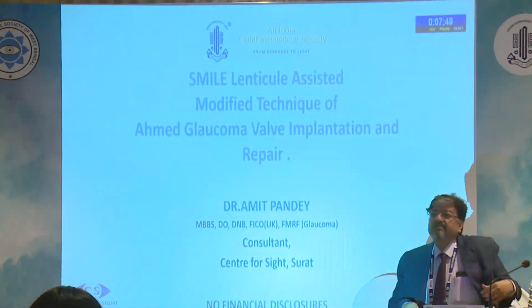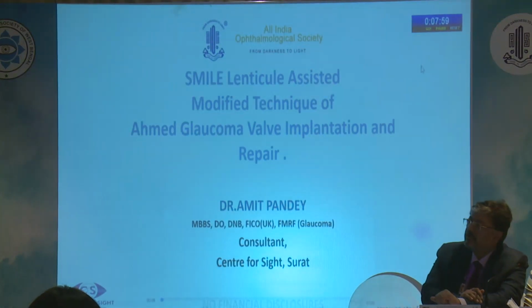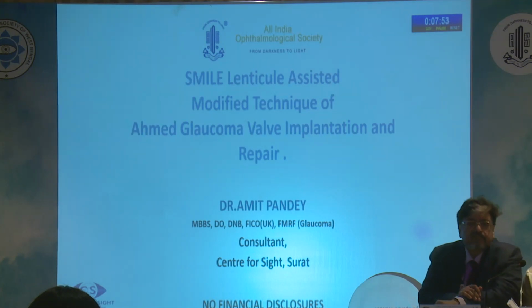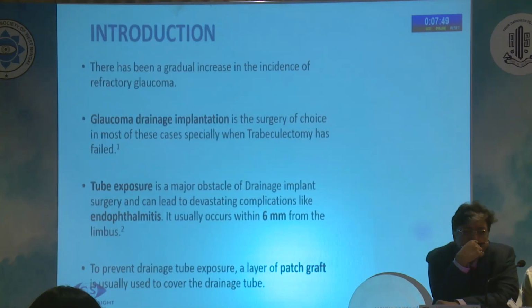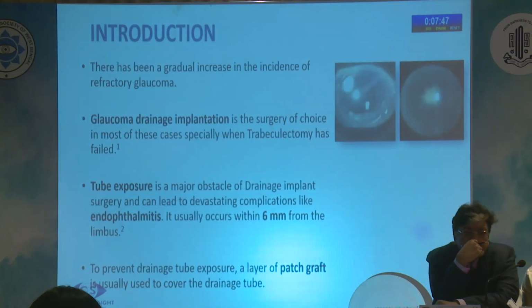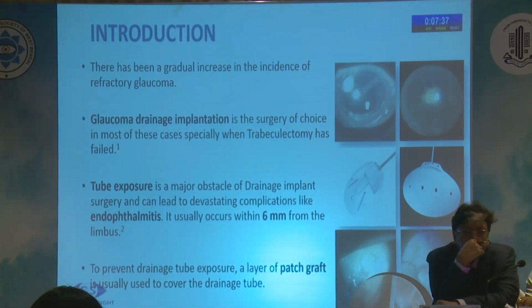This is a two-part video demonstrating an innovative approach to glaucoma drainage device utilizing corneal stromal lenticules sourced from SMILE surgery as a graft material. Glaucoma drainage devices are the surgery of choice in refractory glaucomas, especially when trabeculectomy has failed. But tube exposure is a major obstacle in tube implantation surgery.